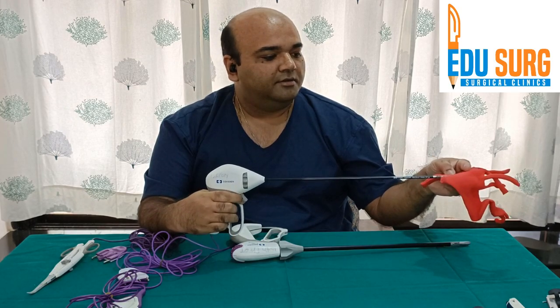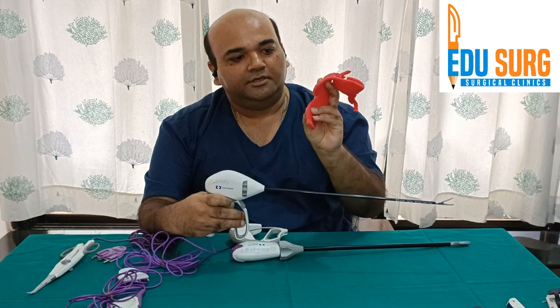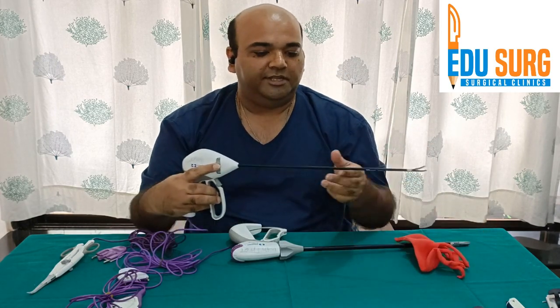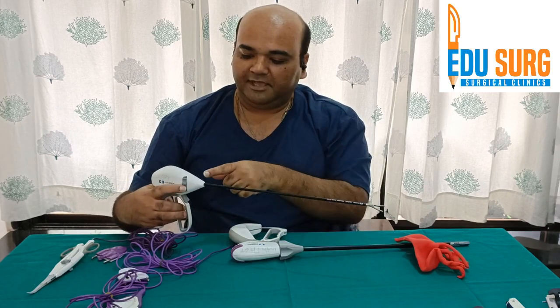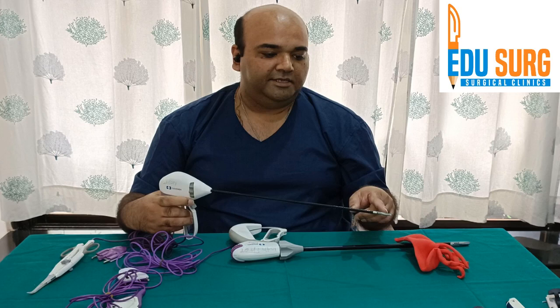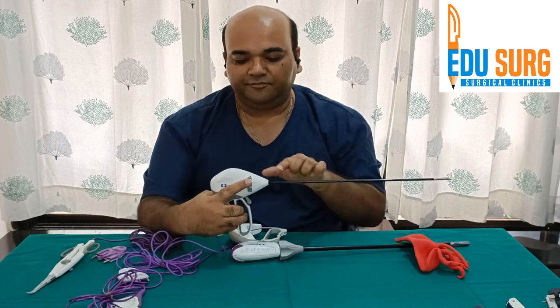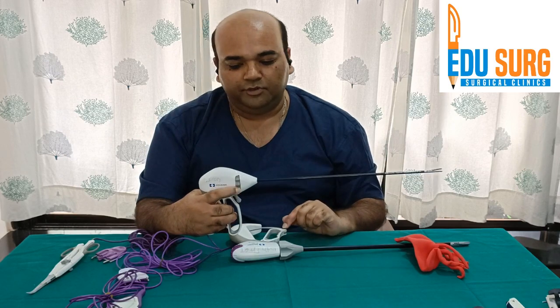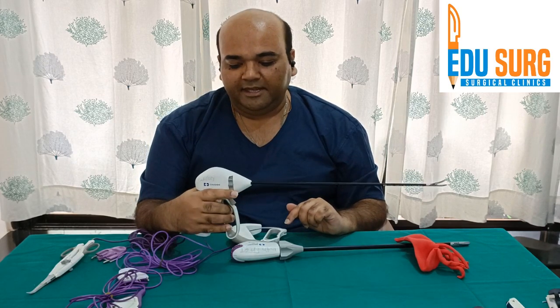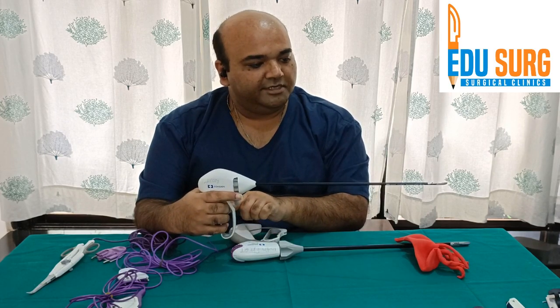You apply the knife and your tissue is cut. You can see that the tissue is cut. The index finger also helps in rotating the device — when you rotate this knob, the blades rotate. You can rotate it in both directions. So the index finger is used for rotating the device as well as for using the blade, while the other fingers help in holding the tissue or dissecting.